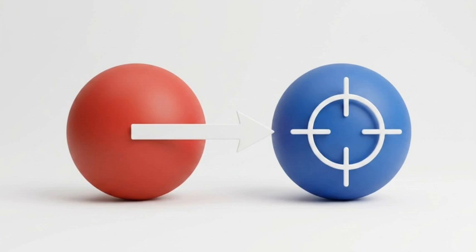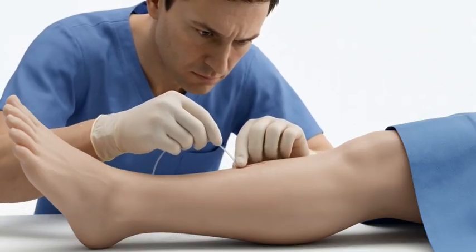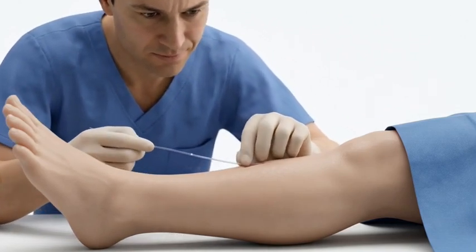This gives us our critical targeting rule for femoral CV lines. Your target vein is always located medial to the arterial pulse. By internalizing this lateral to medial map, you ensure that a large-bore central catheter is guided safely into the vein, preventing dangerous insertion into the femoral artery.